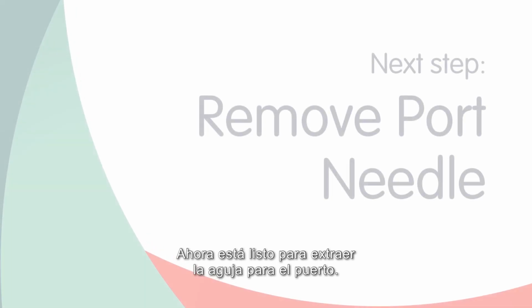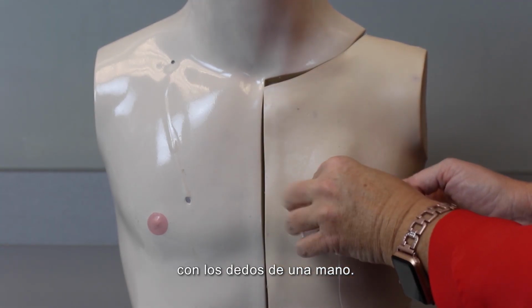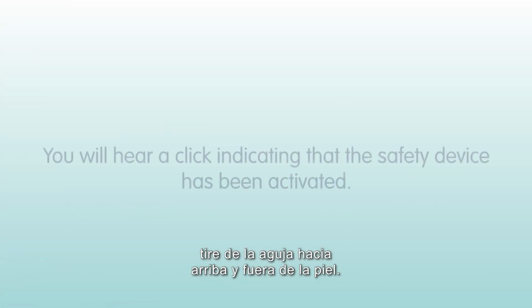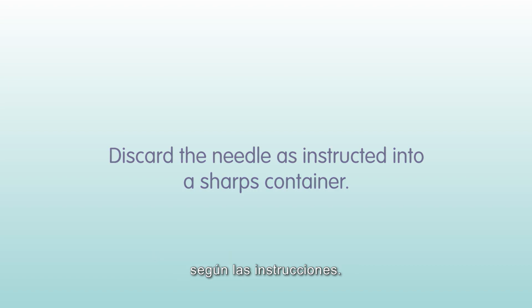You are now ready to remove the port needle. Carefully remove the dressing, holding the port steady with the fingers of one hand. Continuing to hold the base of the port, pull the needle up and out of the skin. You will hear a click, indicating that the safety device has been activated. Discard the needle as instructed into a sharps container.